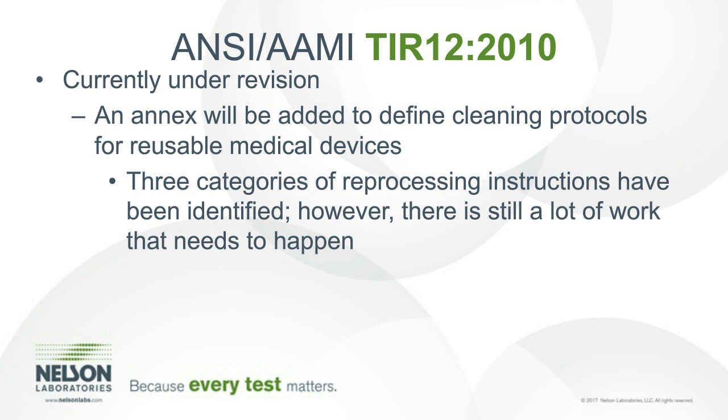But this spurred up when one of the manufacturers said that we have hemostats. And if you look at an IFU for a hemostat, you will probably see 20 different IFUs. How can a healthcare facility use that many different IFUs for cleaning the same product? And that's what spurred up this annex, and that's what we're working towards addressing in this standard.